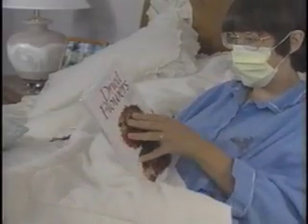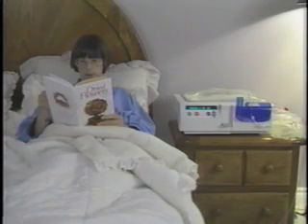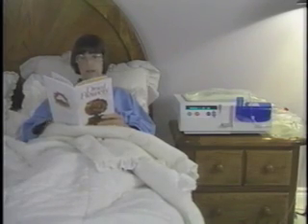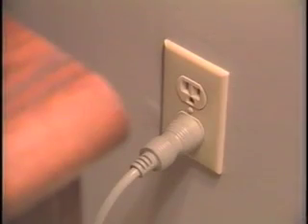At home, the procedure is no different than it was during the dialysis unit training sessions. There are a few things you should check before you start your first home treatment. Be sure the room is clean and well lit. Locate the machine close to your bed. Ensure the 3-prong power outlet is properly grounded.